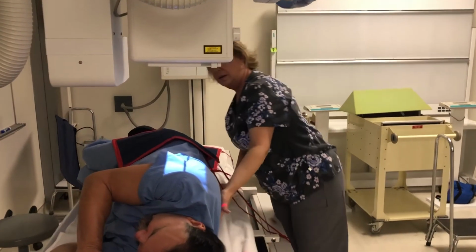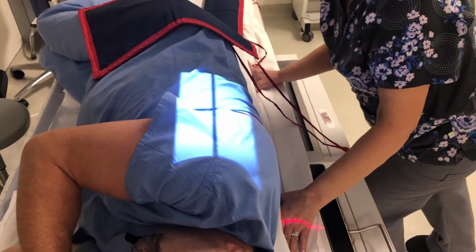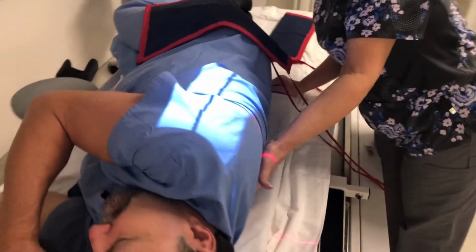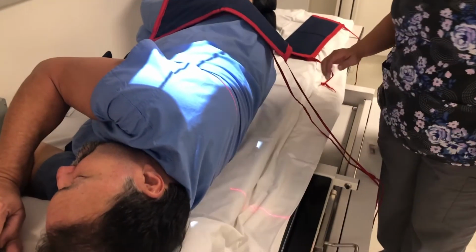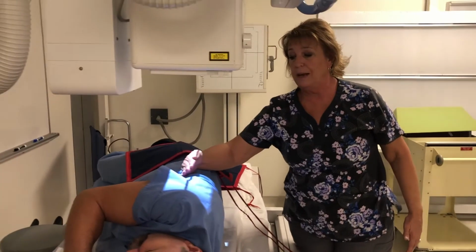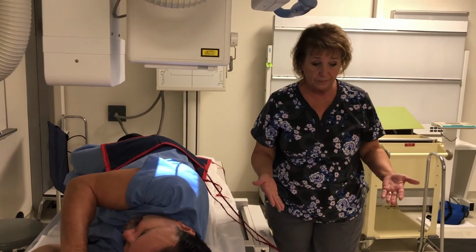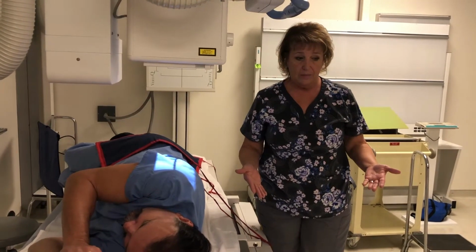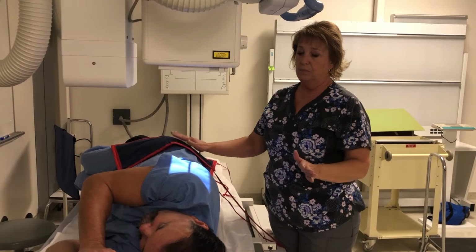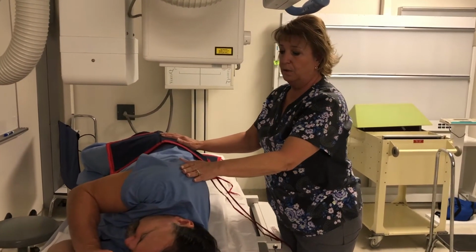So we're centered on the spine. I'm going to bring him just a little bit more anterior. That is our oblique, AP oblique. So starting from lateral, roll the patient back 20 degrees. If he was prone, you would be rolling 20 degrees forward from lateral.